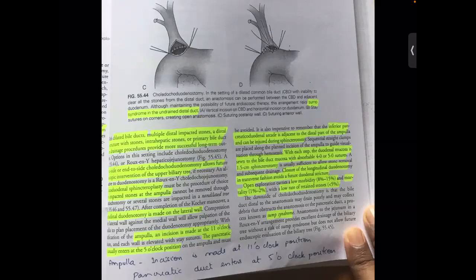The suture material is absorbable 4-0 or 5-0, like Vicryl. Any absorbable suture material should be used for the duct mucosa anastomosis. A 1.5 centimeter sphincterotomy is usually sufficient to allow stone removal and subsequent drainage.